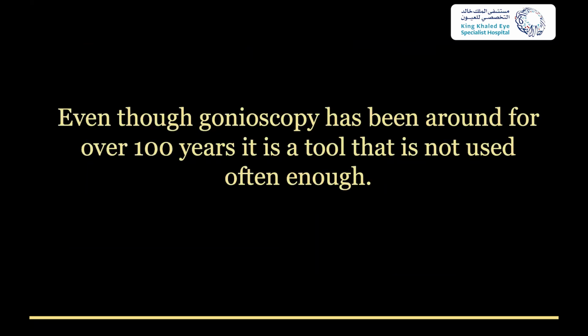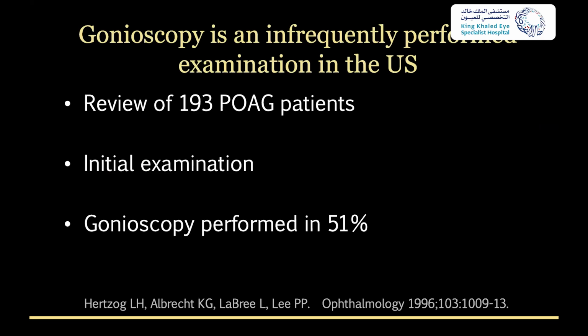Gonioscopy has been around for over 100 years. At least in the US, it's not used enough. A study by Dr. Paul Lee's group looked at 193 glaucoma patients, and on their initial exam, only half had gonioscopy. And these are people with glaucoma, not just random people in the clinic for a contact lens fitting or something.